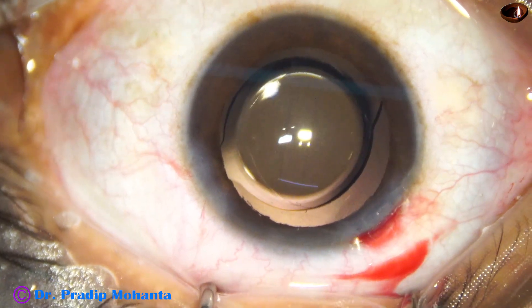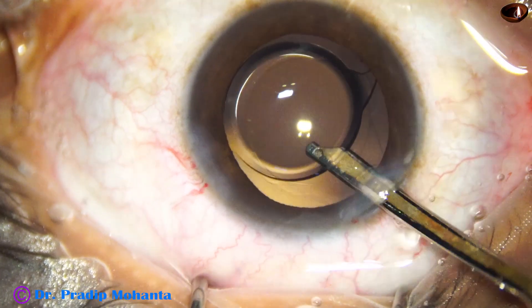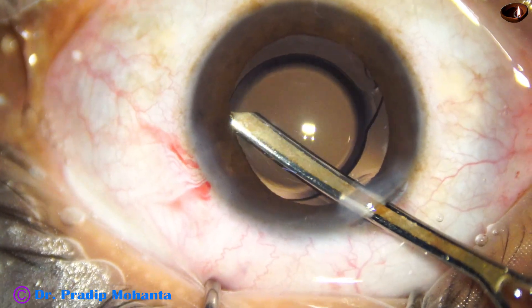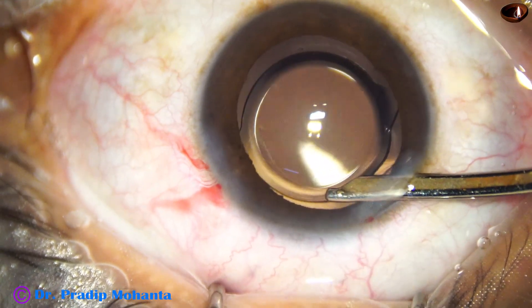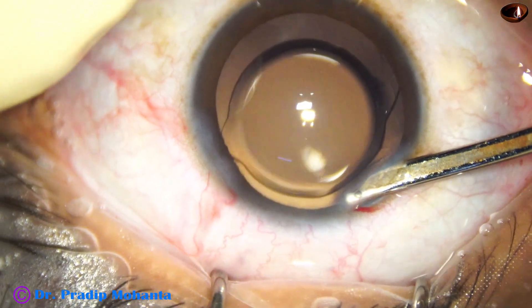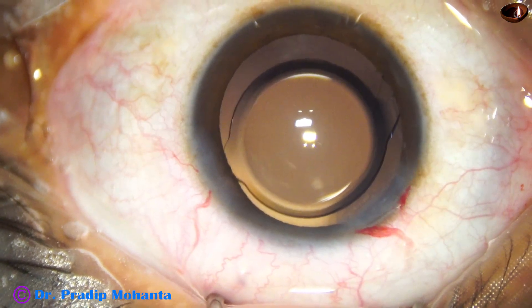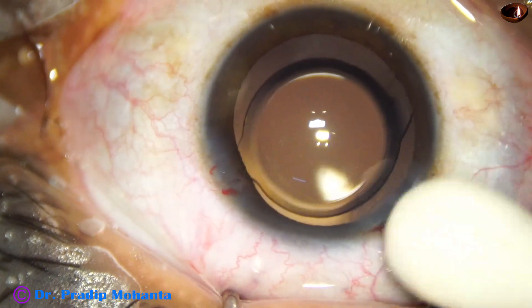A final lavage of the anterior chamber is done. This is very important to get rid of debris. If we leave a clean field at the end of the surgery, the postoperative inflammation is much less. I form the anterior chamber nicely, then take a cotton-tipped applicator, check the integrity of the wound, and find there is no leakage. I conclude the case.